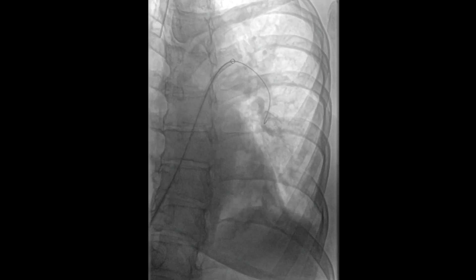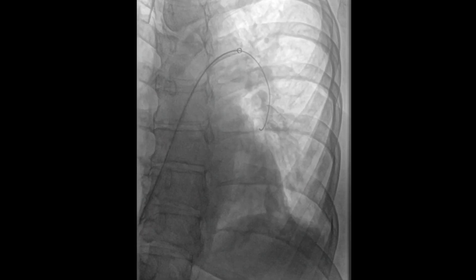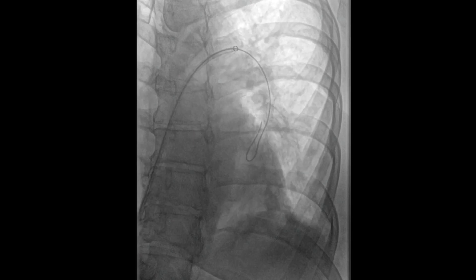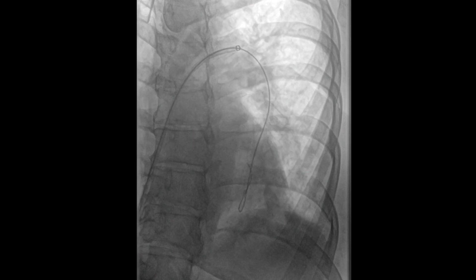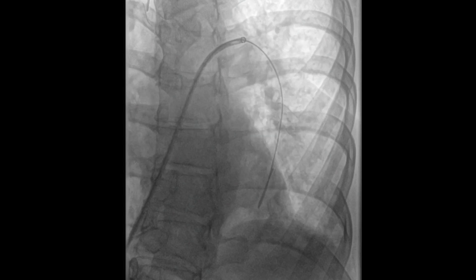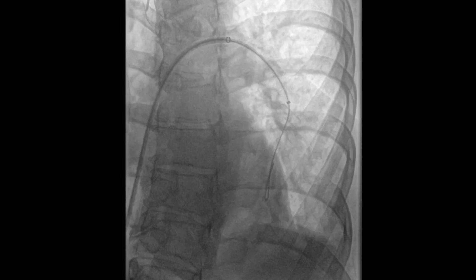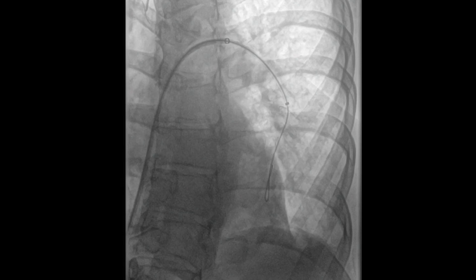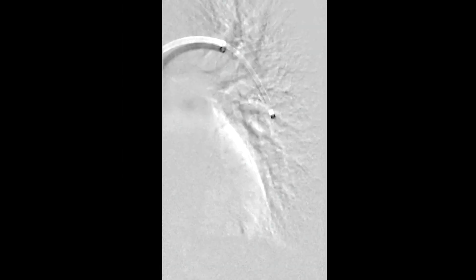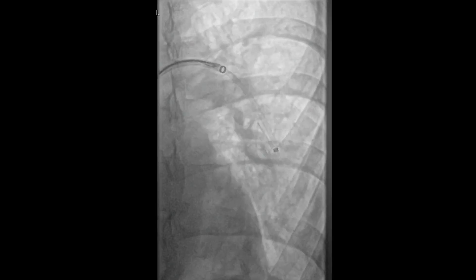We then carefully introduced our wire into the left lower segmental pulmonary artery. This was followed by advancement of the ensnare catheter into the left lower pulmonary artery as well. Repeat angiogram confirmed placement of our catheter within the left lower segmental pulmonary artery.